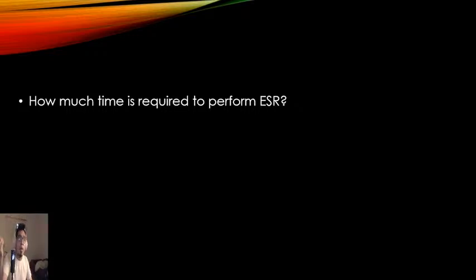So the whole thing is like an RBC counter, and it just measures the velocity of the RBCs falling in the solution. So it's one way for the ESR to be performed.